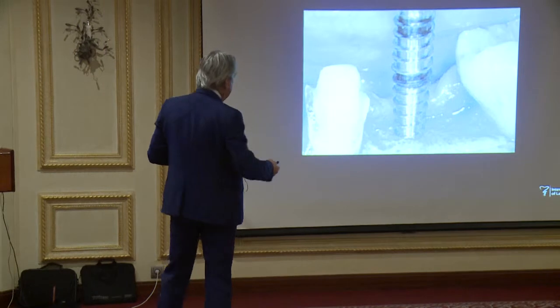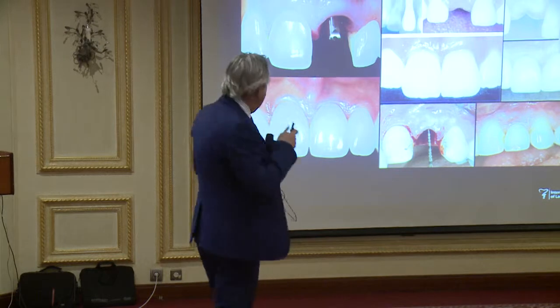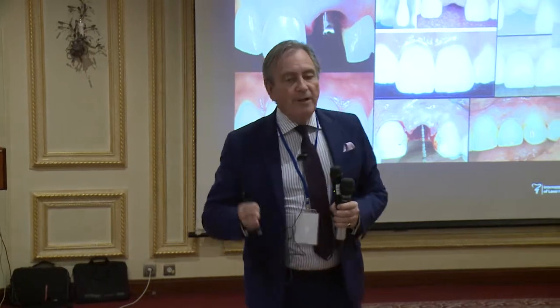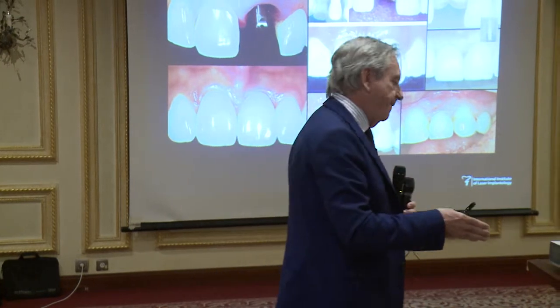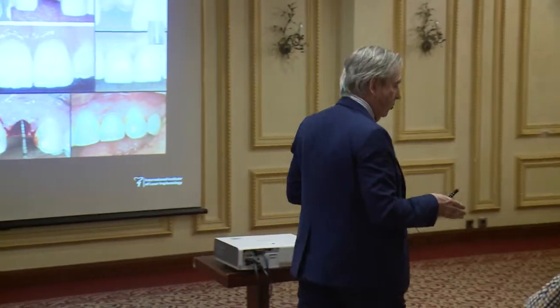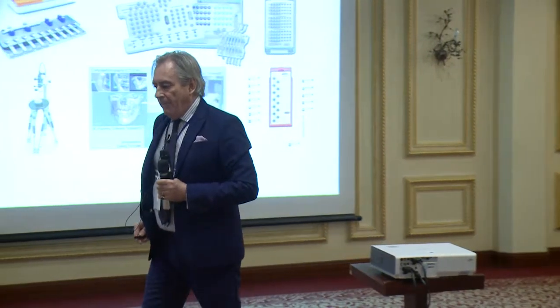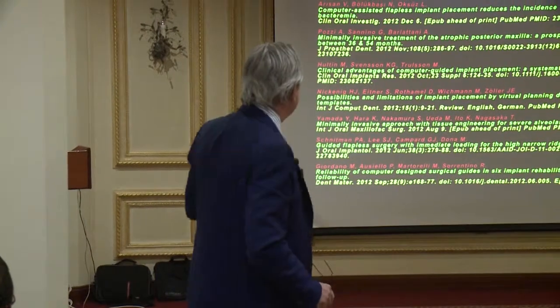Anyway, let me go to the technique. The technique represented by flapless. Flapless is fundamental. But even if flapless has an issue in terms of scars or resorption, both on hard and soft tissue, we know that since we're working with surgical navigation, think about surgical navigation systems.